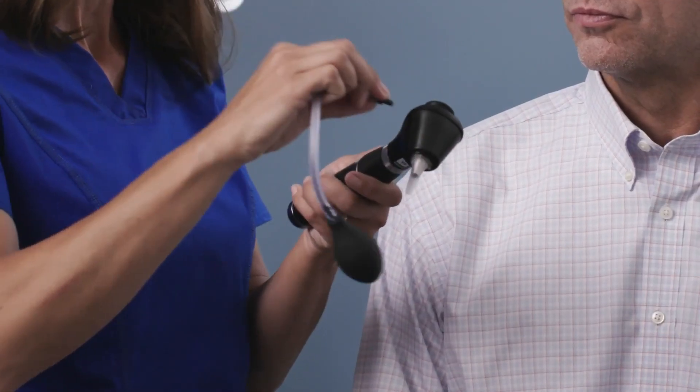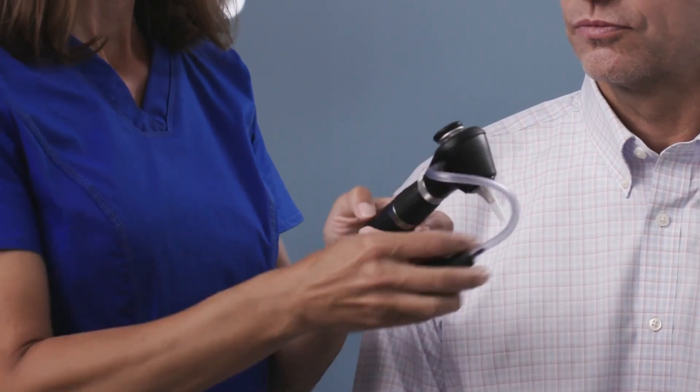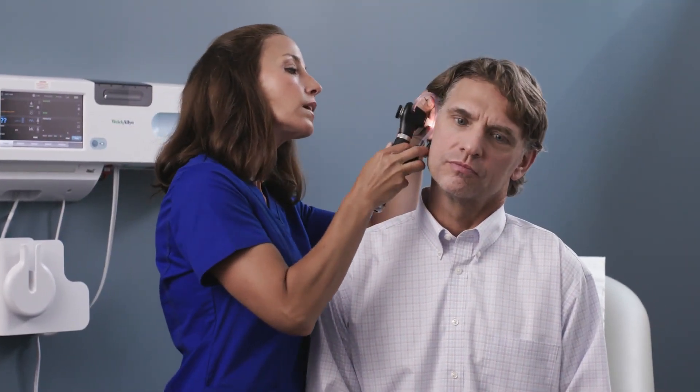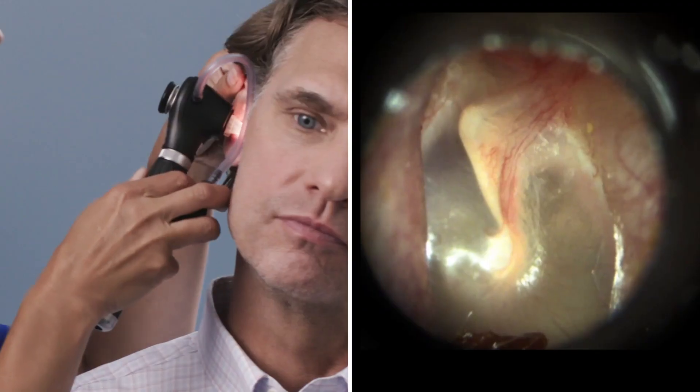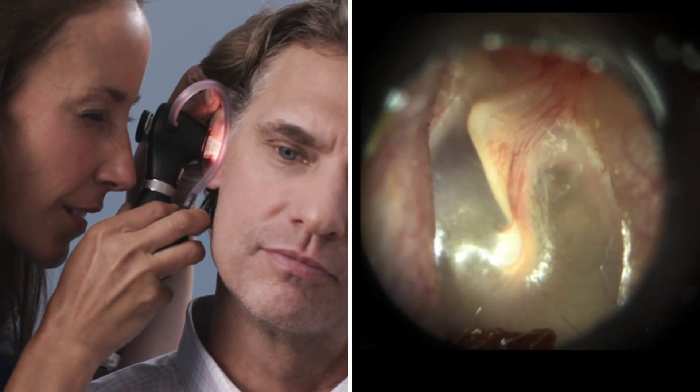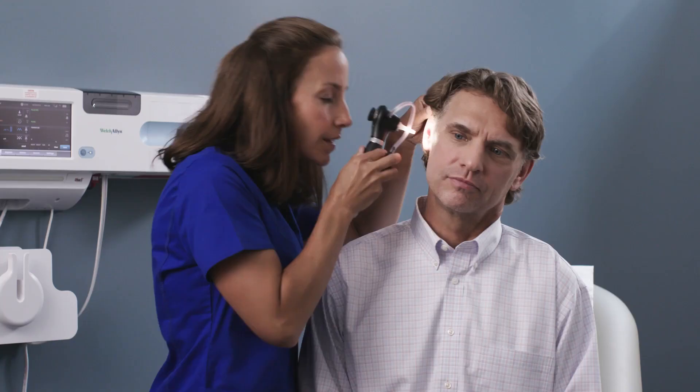Pneumatic otoscopy helps detect ear effusion or fluid behind the eardrum, which can be a sign of infection. The optional insufflator bulb attaches to the side of the Welch Allyn MacroView Plus. Use Welch Allyn Soft Seal Disposable Sealing Tips over Welch Allyn Ear Specula for a tighter seal against the ear canal wall during pneumatic otoscopy. Use the insufflator bulb to gently puff air at the thin membrane. A lack of movement may be a sign that fluid is present, even if it's not visible.